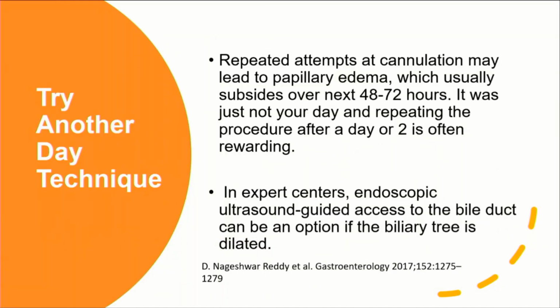We should not forget the try another day technique, as Dr. Reddy mentioned 5 years ago in a publication. Sometimes it's not a good day for the doctor, or it's not a good day for the patient. Repeated attempts may increase the risk of complications, especially post-ERCP pancreatitis.